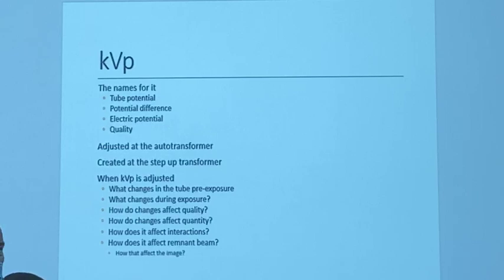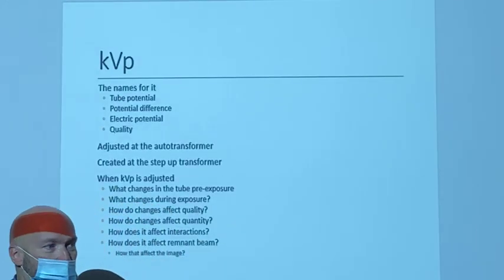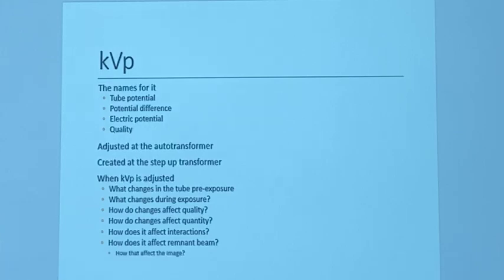Okay, so you get into clinicals and you start playing around with the machine, not on a patient, but you just start shooting things, which I really recommend that you do. Just find something, walk into a room, start blasting away on it. And it can be almost anything. Sharps container, it can be shoes, it can be whatever. If you happen to have a skull phantom, shoot it.